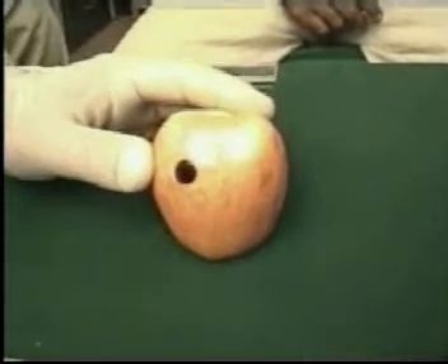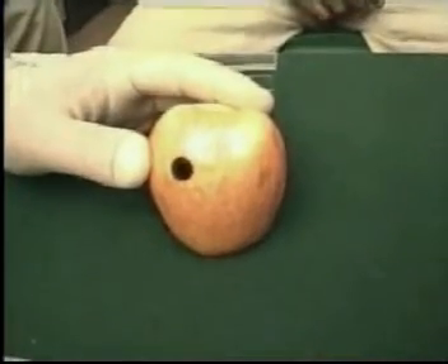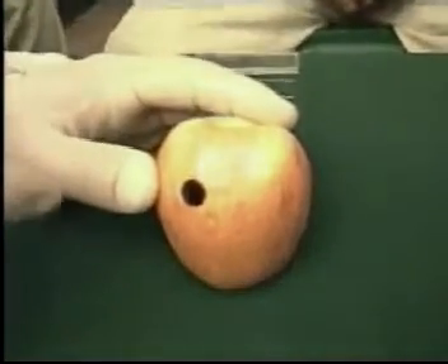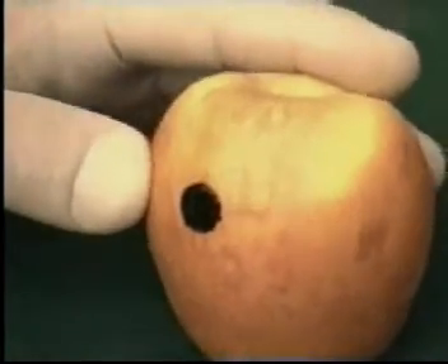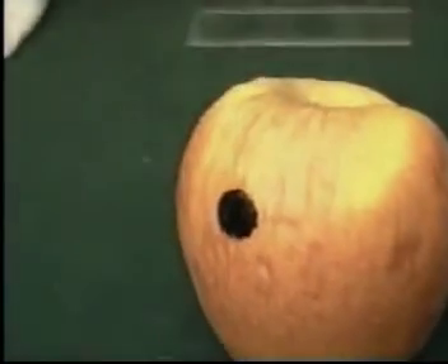Now if you look at this apple, this is a simulated growth — let's say in breast or in thyroid. The black spot marks the area of the skin under which this lesion lies. Now we shall perform the FNAC.